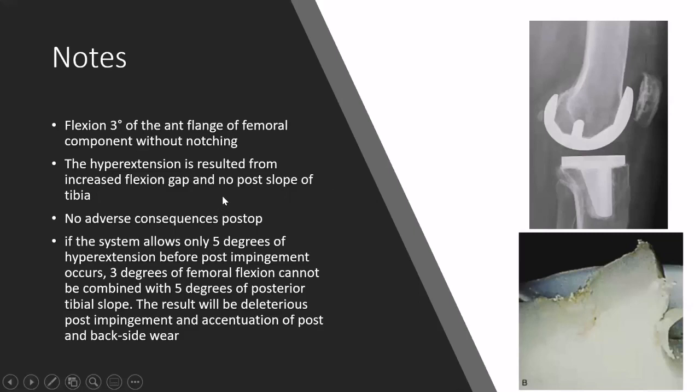But we have something important, which is the slope of the tibia. We said in the alignment that in the sagittal plane there is a slope of the tibia. Here, in this system, which makes flexion of the component of 3 degrees anteriorly in order to maintain more posterior resection, and it compensates in the component here without an offset.